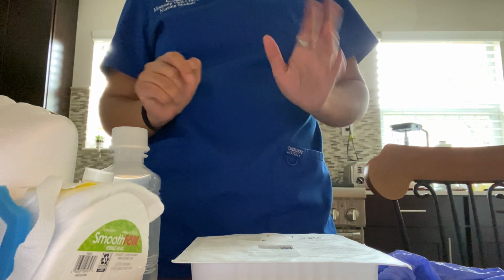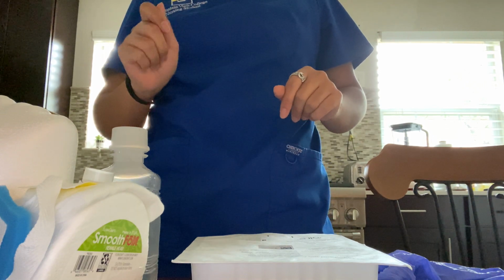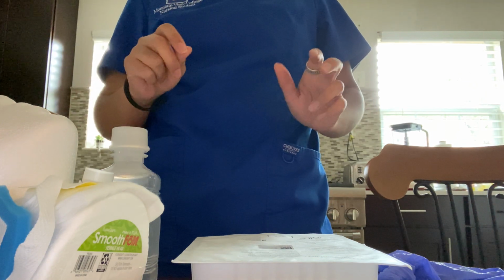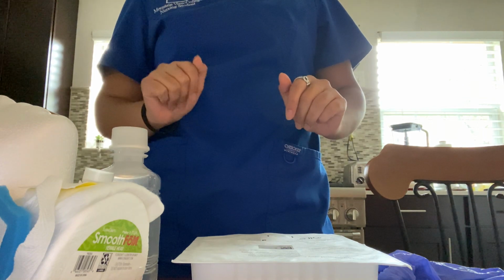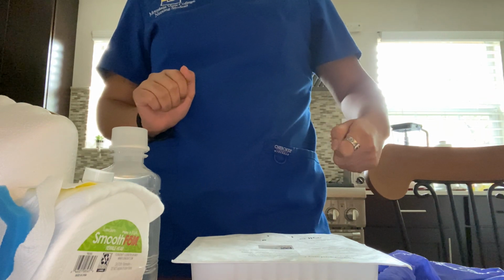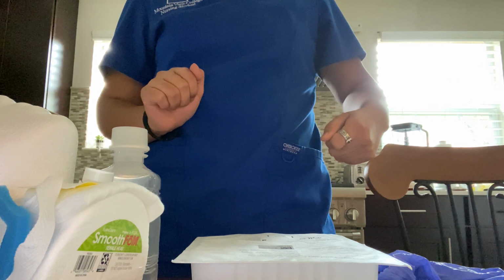So you're going to remove your trach suction kit. Make sure it doesn't touch anything. In my sterile hand I will hold the whistle tip suction and my catheter that will go in. My dirty hand will have the suction tubing, the part that you put your finger on and off to make sure that the suction is working.